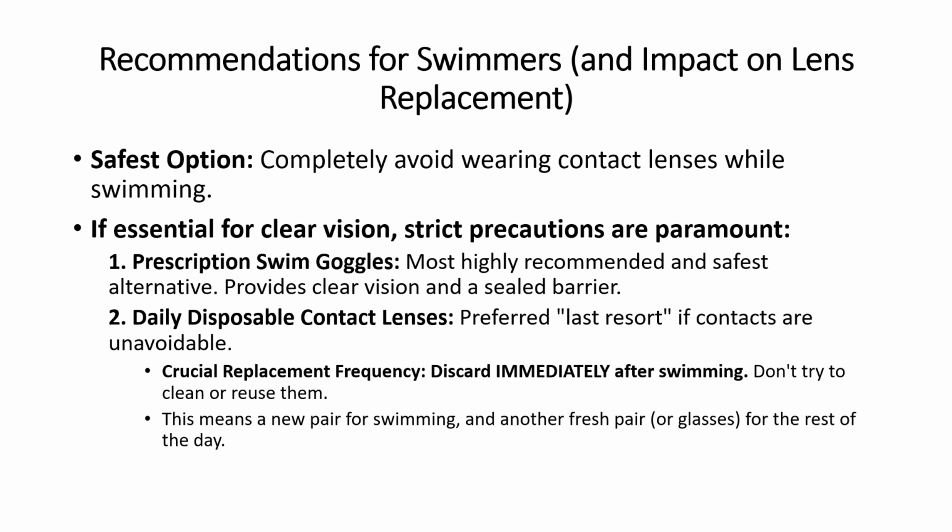The crucial recommendation here is to discard them immediately. After swimming, do not try to clean or reuse them, even for a short period. This eliminates the need for disinfection after potential contamination and ensures you start with a fresh, sterile pair. This might mean using one pair specifically for swimming and another fresh pair for the rest of your day.